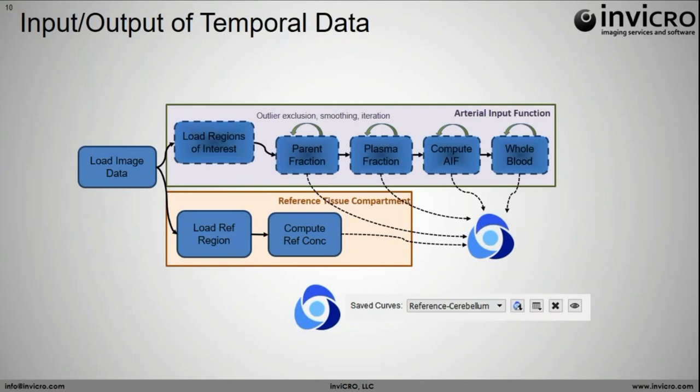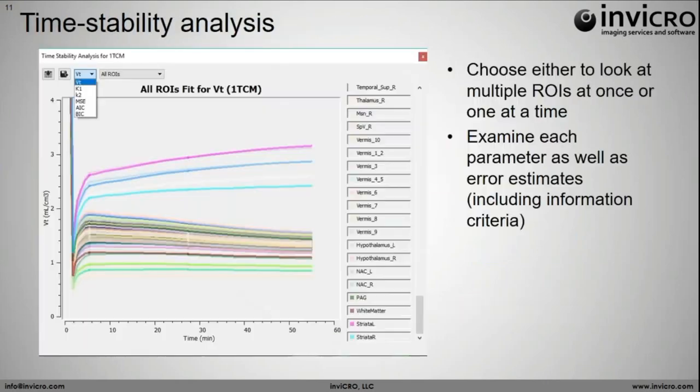In addition, you can visualize previously saved curves, and all these things get stored in the nice session manager in VivoQuant as well.